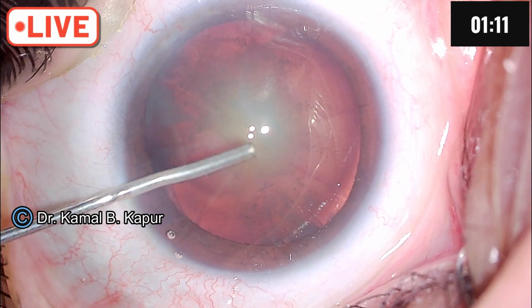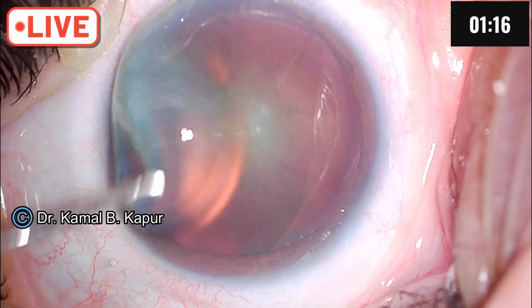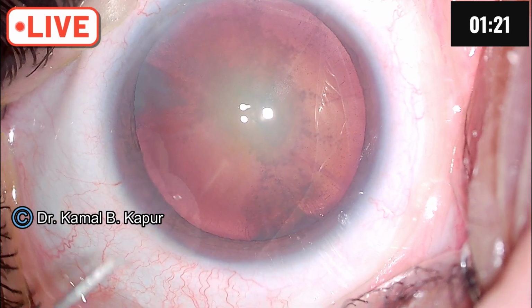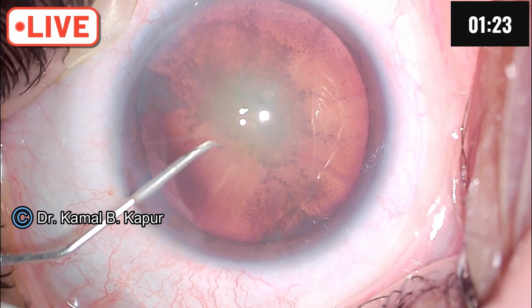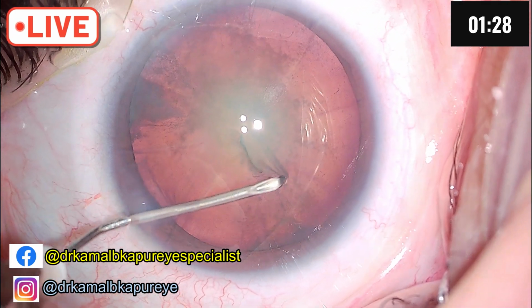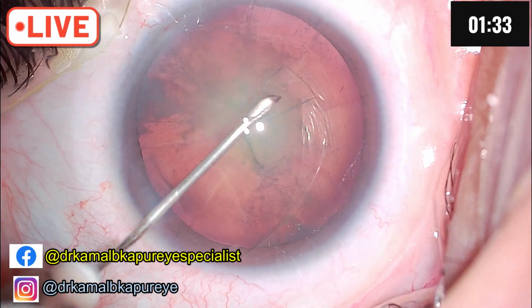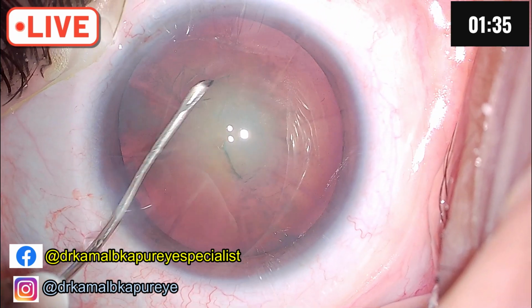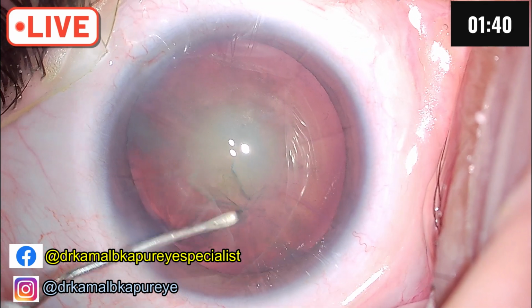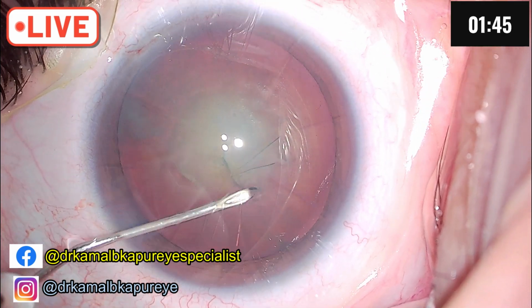A few things to take care of when planning such a case: you should incorporate new formulas, inform the patient of instability of refraction for the first couple of weeks, and also plan your IOL to be toric only if the patient was improving with toric glasses or astigmatism was regular, and the cylindrical refraction has been stable over a reasonable time.